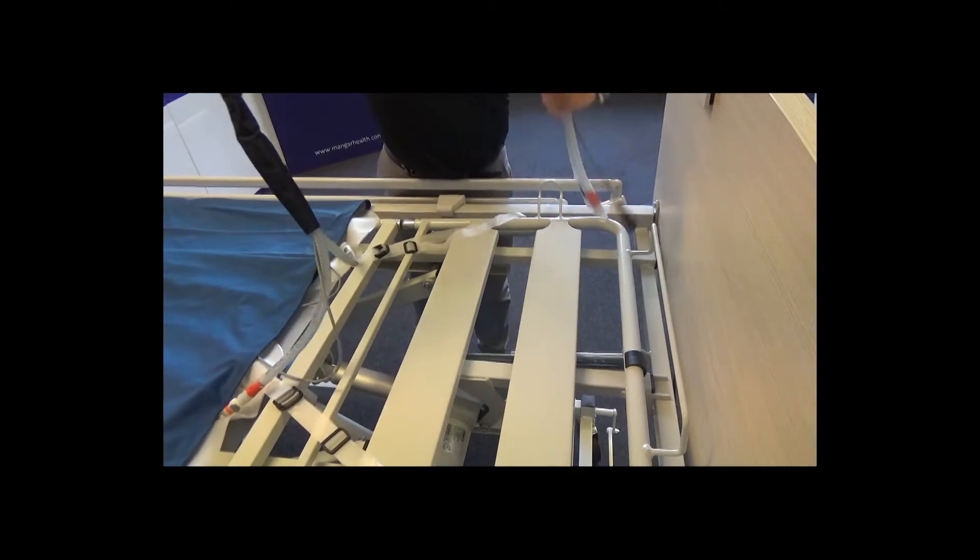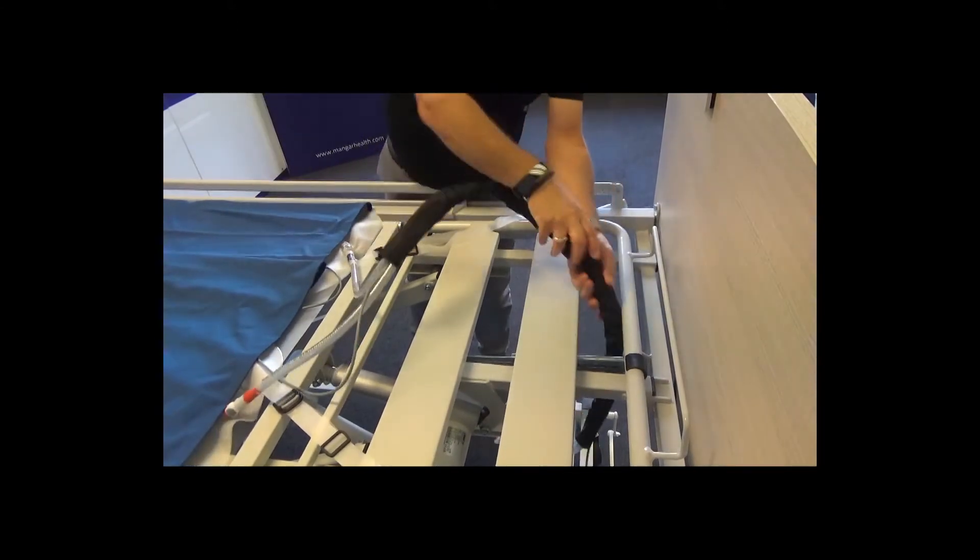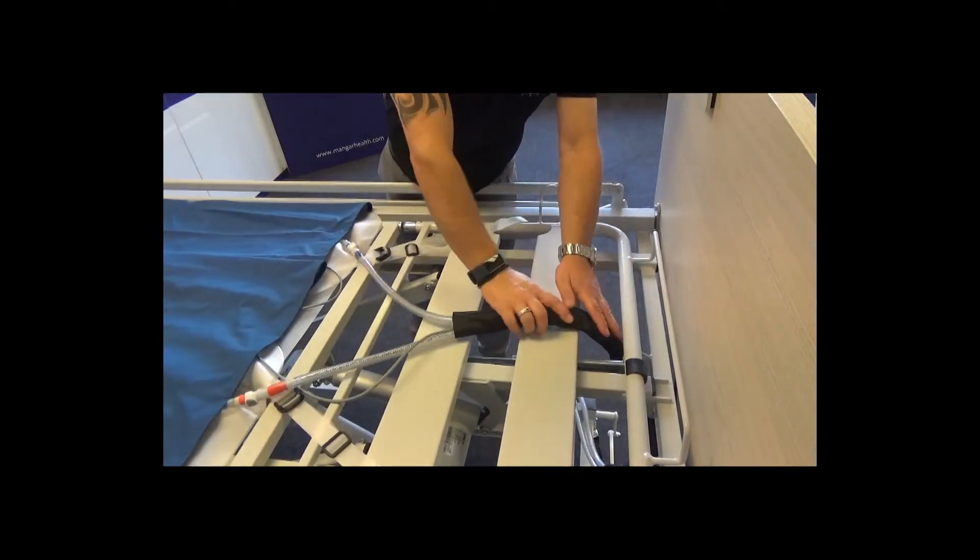Feed the air tubes and sensor lead through the base of the bed, keeping the cables clear of any moving parts.